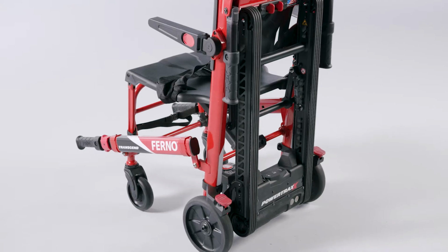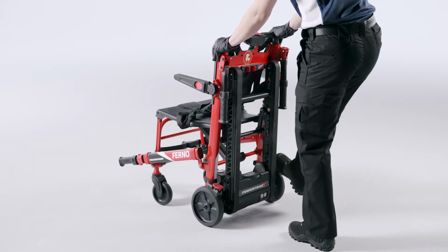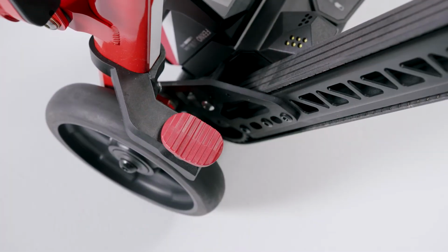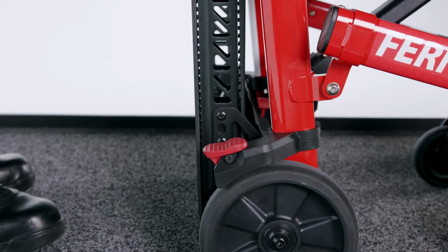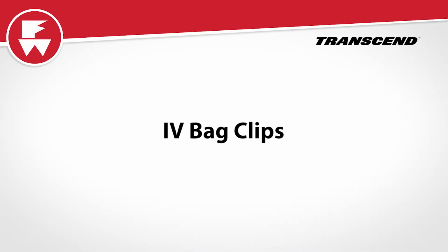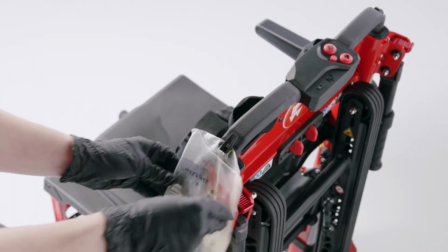The optional wheel locks are located on the rear wheels of the chair. To lock, press the lever down. To unlock, press the opposite end of the lever. The lift bar has a clip at each corner to easily attach an IV bag.